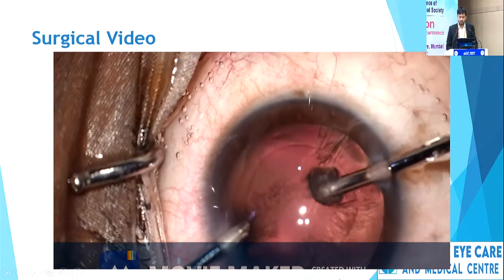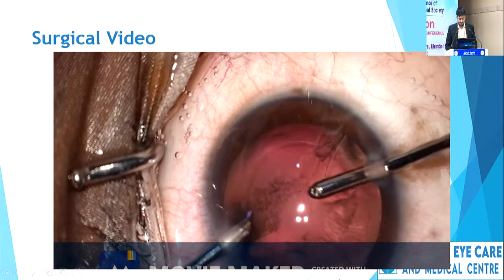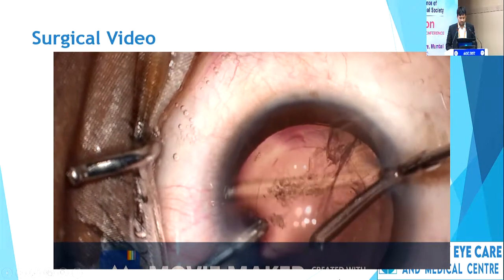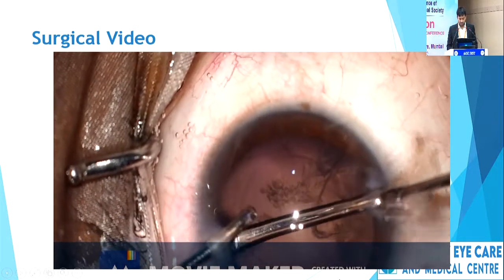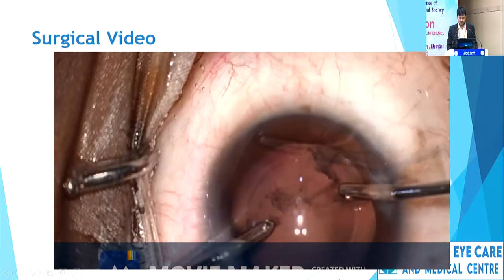You need to do a thorough cortical cleanup, with no remnants of cortex. AC polishing would help to delay the capsular fibrosis and help in the better centration of the lens.